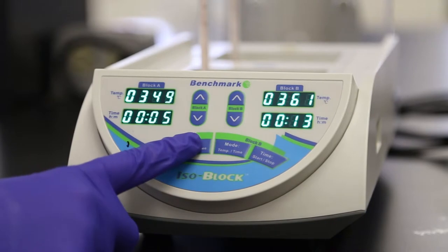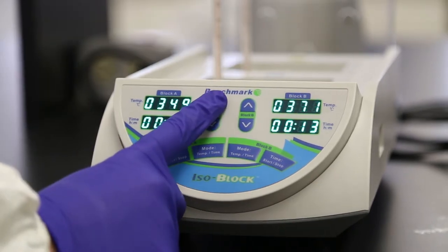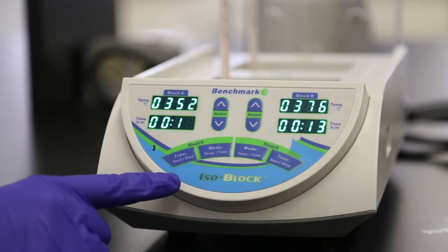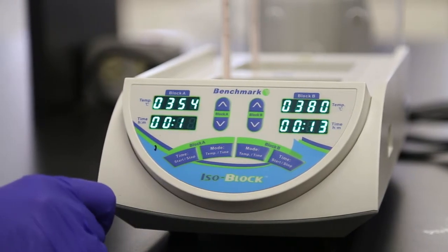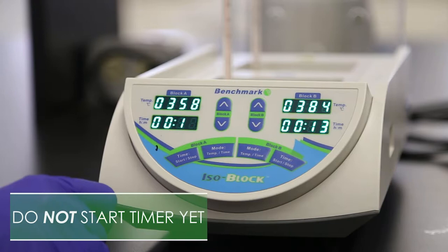To use the built-in timer, press Mode, Temp, Time for Block A twice to select the time setting for Block A. The last digit of the selected setting will flash. Note, the display includes hours and minutes. Using the Block A arrow keys, press and hold the up or down to set the timer to 10 minutes. Don't start the timer yet.